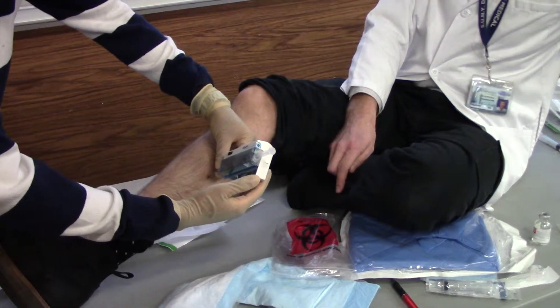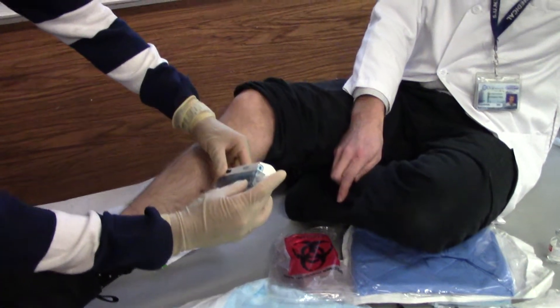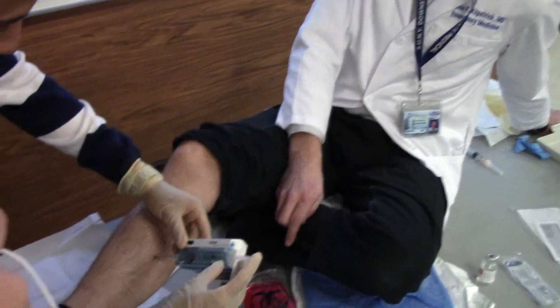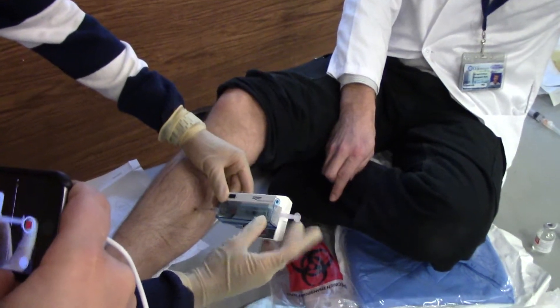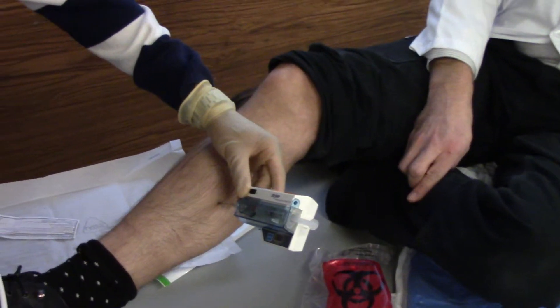About half a CC — it's half a CC. And the numbers are going to go huge, which makes sense. It has to equilibrate within that compartment. At the beginning it's going to loop up to 60 and everything else — that's not the final reading. So you just wait until it stops; you're seeing what it settles out to.